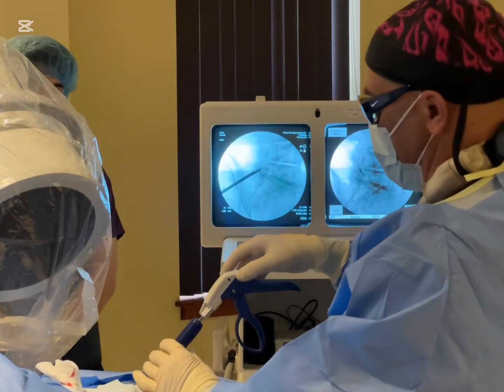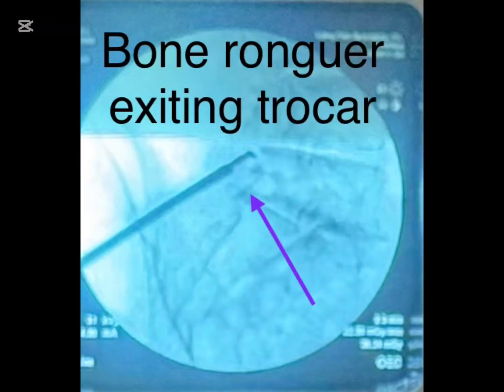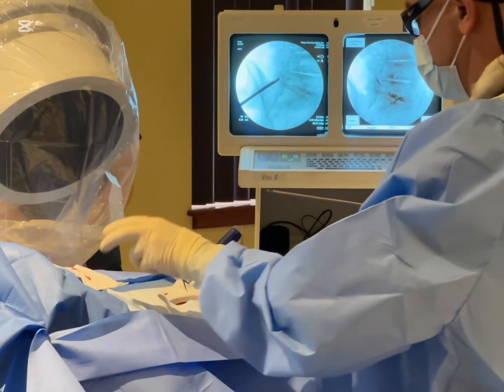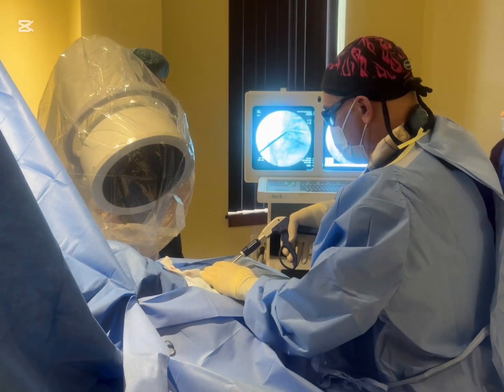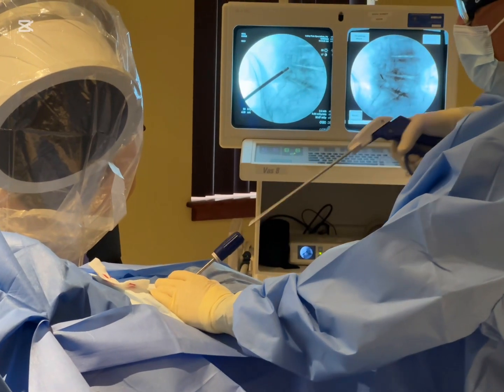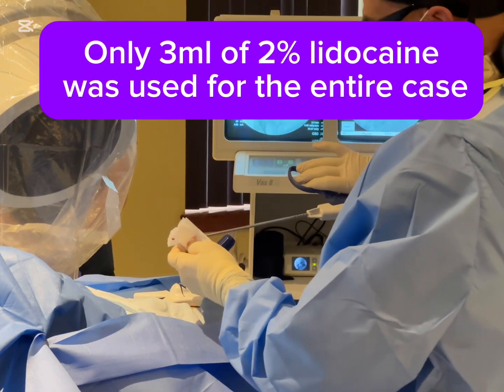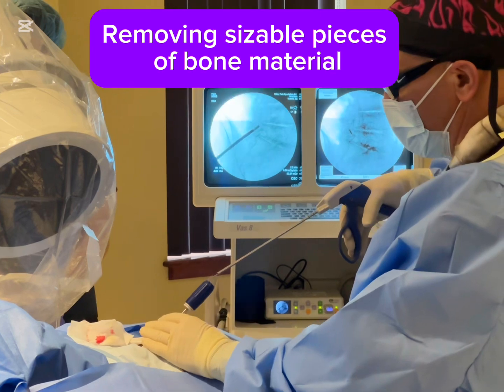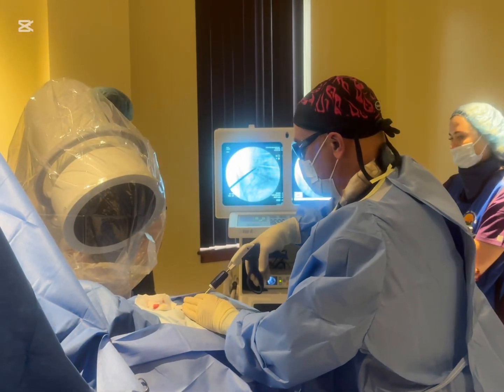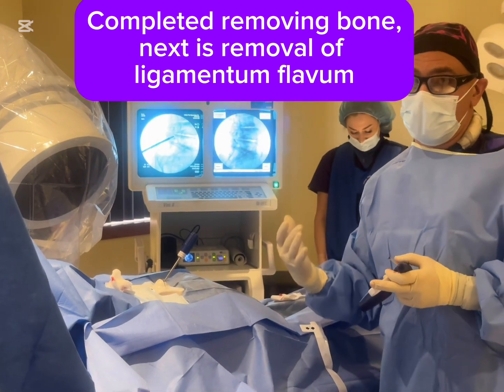So there it is — we're decompressing her spine. You can feel the punches of bone coming out. It's not hurting the patient. I'm not hurting you am I, Doris? No. Good. Everything's going fine, we're moving right along here. We're taking the bone out to get you more room for those nerves. This is a lot better than having back surgery. We did that with the bone rongeur removing the superior and inferior lamina and we've gotten good chunks of bone tissue out.